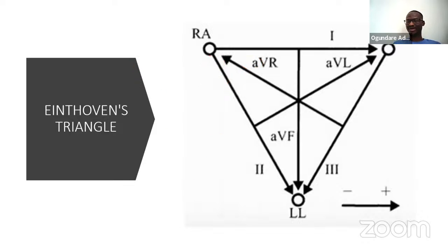And another takeaway before I let us go, is that it is this same understanding that gives birth to the 3 cable ECG and 5 cable ECG. Okay, I'm sure for continuous monitoring, sometimes we use just 3 cables. It is this understanding that gives birth to that. So you have just an electrode on the right arm, another one on the left arm, then another one for the left leg. And these are used for continuous monitoring.